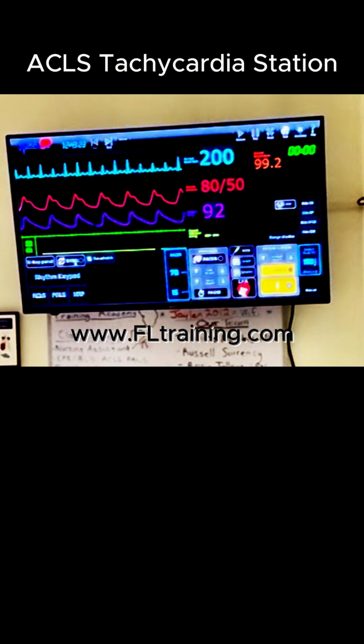Right now, she's talking to you. She doesn't feel well, but we want to make sure that we sync it so that whenever the energy is sent, it's going to hit at the top of the QRS complex and not after it, so that the person doesn't go into VFib. All right, so she is awake. Let's say she is 50 kilograms, so she's approximately 100 pounds. How much energy do you want to give somebody who's awake? We can start with 50.